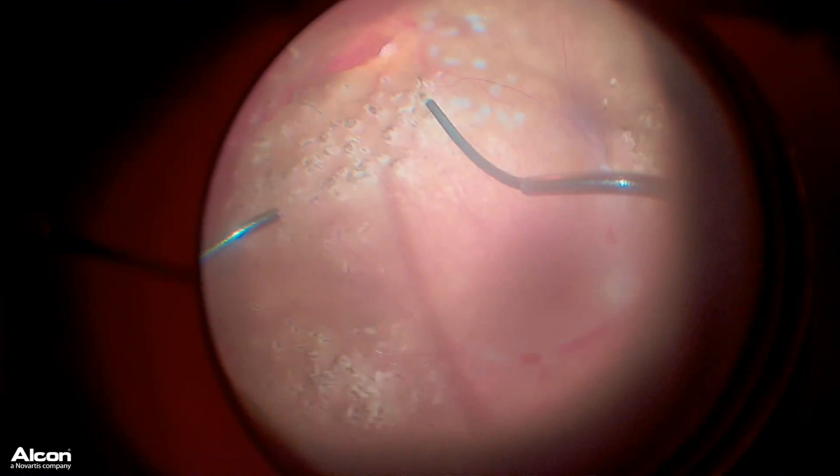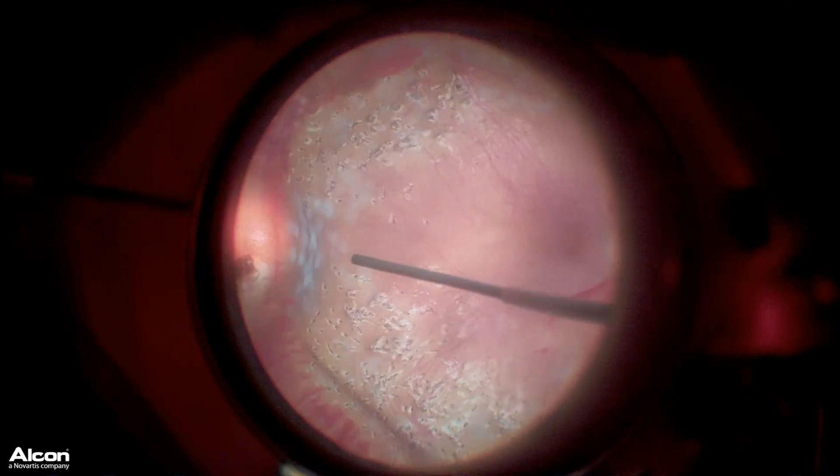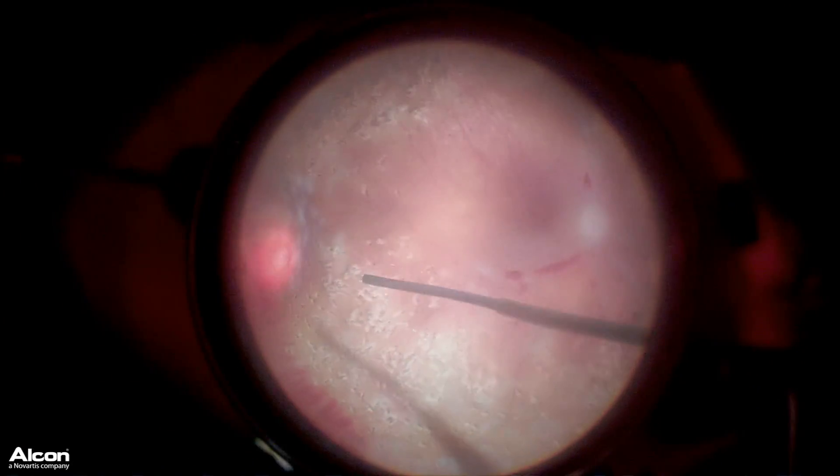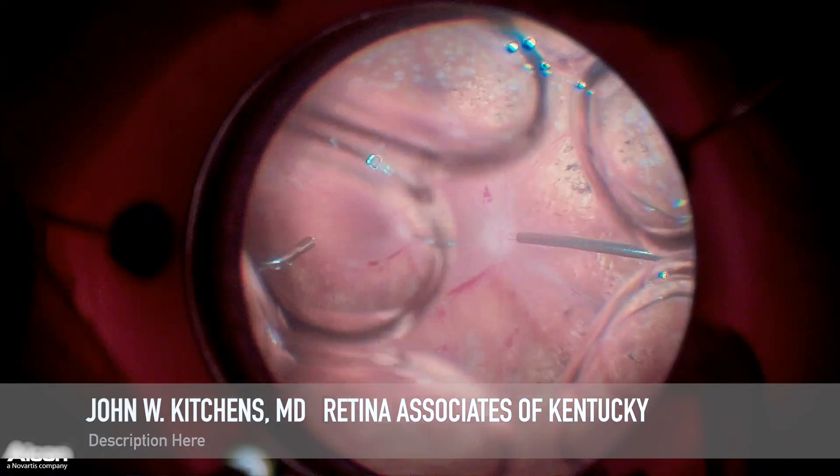One of the things we like to do, if a patient has not received a full amount of laser treatment, is when we're done with our peeling and have removed all the scar tissue, apply adequate laser to the peripheral retina.